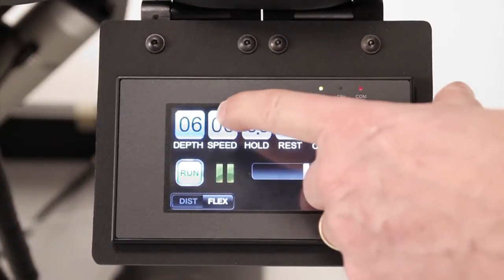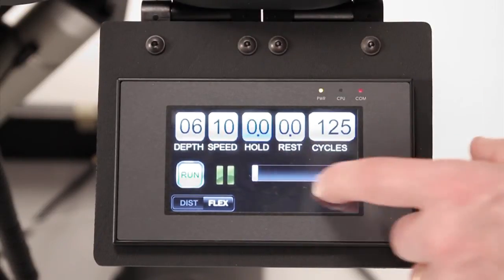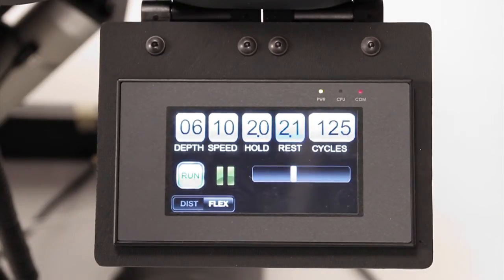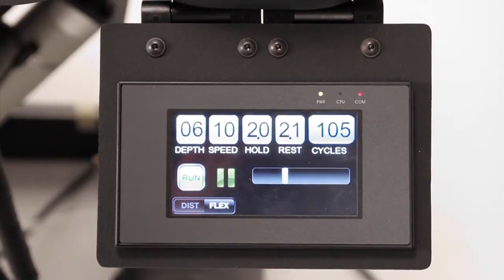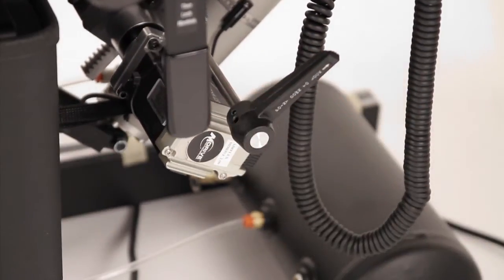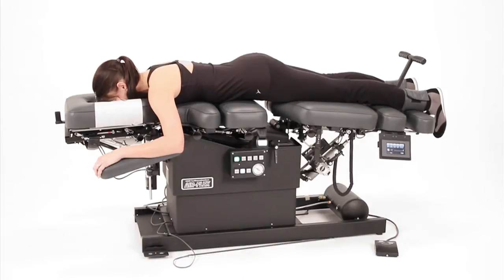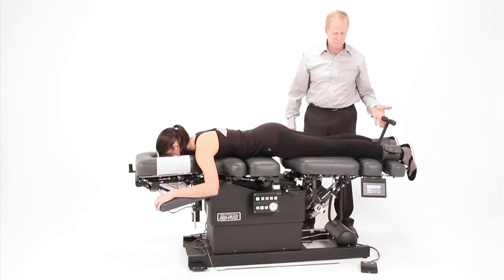Use the touchscreen to adjust your desired settings for flexion depth, speed, flexion hold time, and rest time. You can also adjust the amount of cycles for any given treatment. When all desired settings are entered, touch the green Run button. The Run button will activate the automatic flexion motor. Turn the flexion handle to the 1 o'clock position to start treating with automatic flexion. You may insert the tiller bar and perform circumduction with the tips of your fingers without pushing down or bending over.